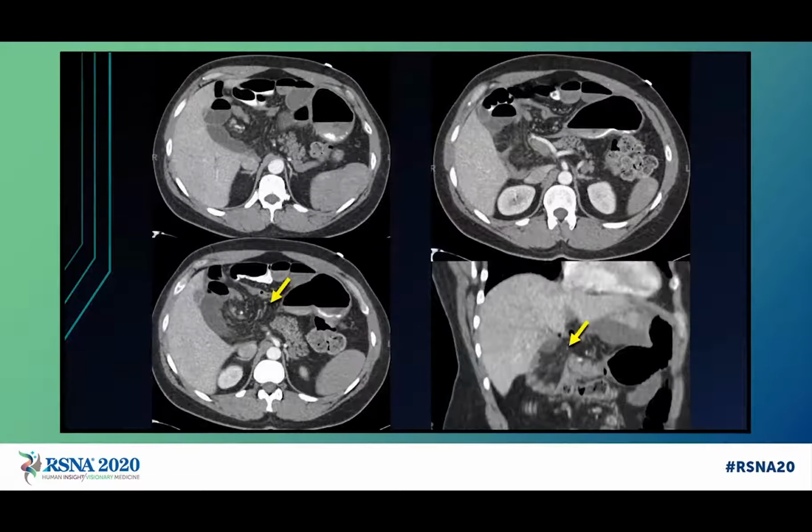Here's a more subtle case of a patient with an internal hernia causing his acute presentation to the ER. Notice the abnormal mesenteric fat touching the gallbladder, bowel loops touching the gallbladder up in the porta hepatis. This is a patient with a foramen of Winslow internal hernia causing his acute abdominal pain. This was corrected surgically. In my practice, this is the exception though. We normally don't see anatomic hernias very often.